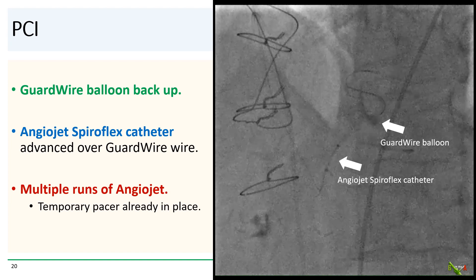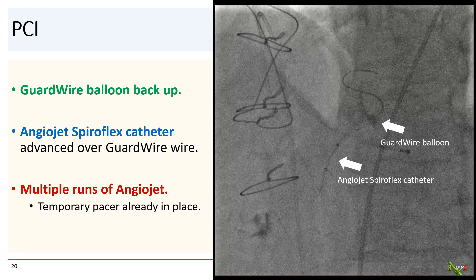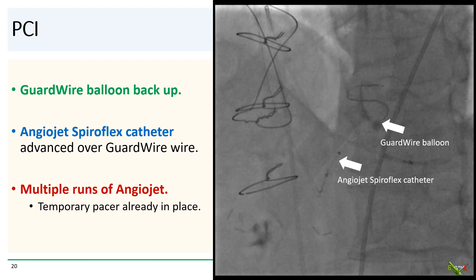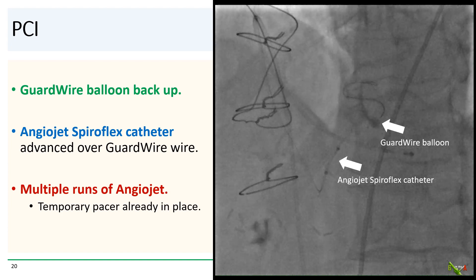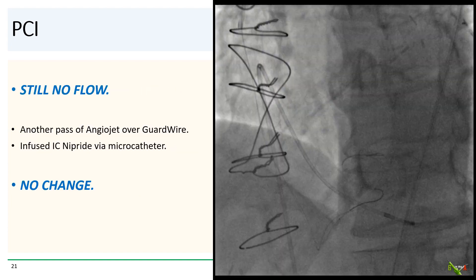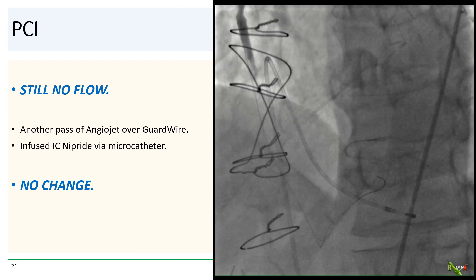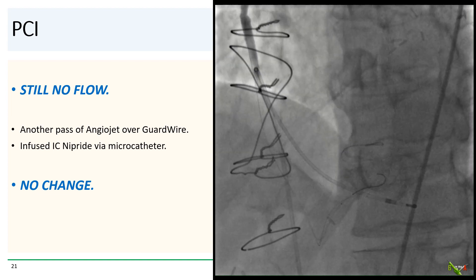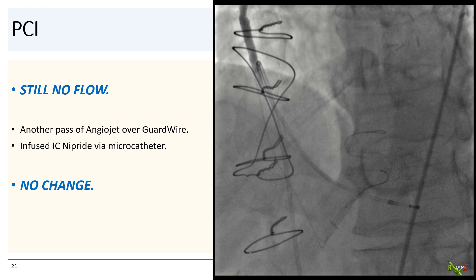Here we have the guard wire balloon back up and the AngioJet Spiroflex catheter advanced over the guard wire. We did multiple runs with the AngioJet — we already had the temporary pacemaker in place. But after AngioJet there was still no flow. We did another run of AngioJet along with infusions of intracoronary nipride distal to the thrombus using a microcatheter, but there was still no flow.